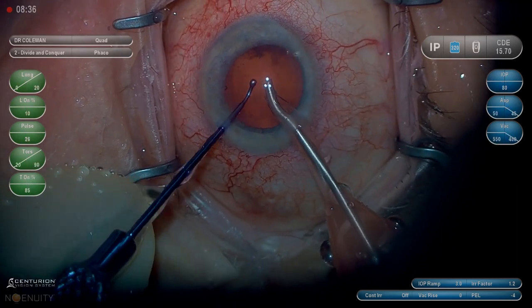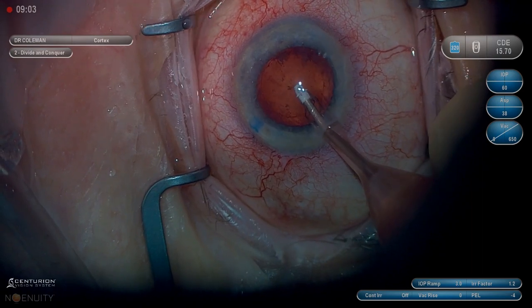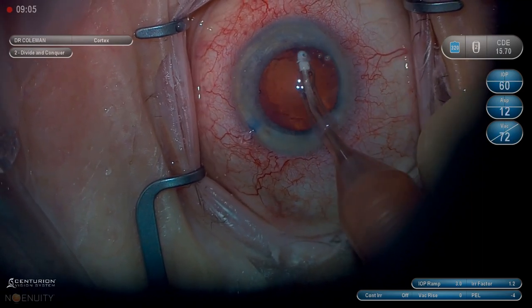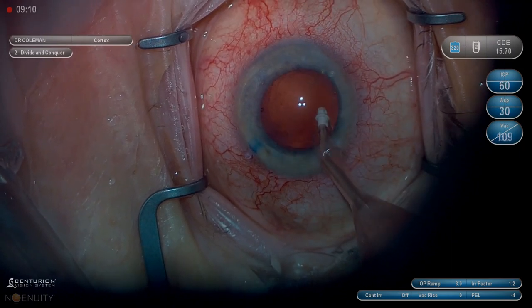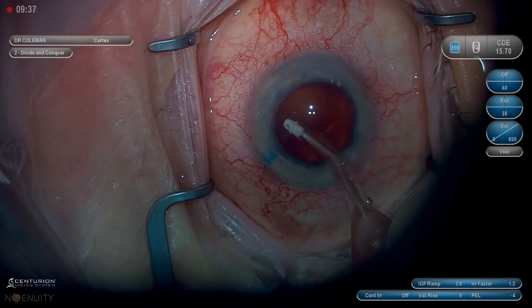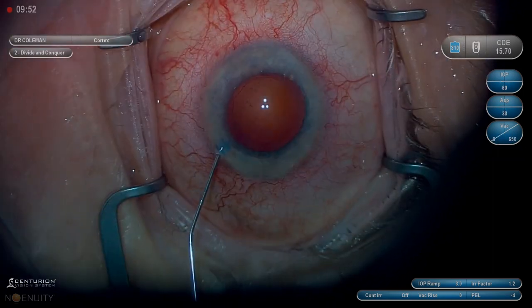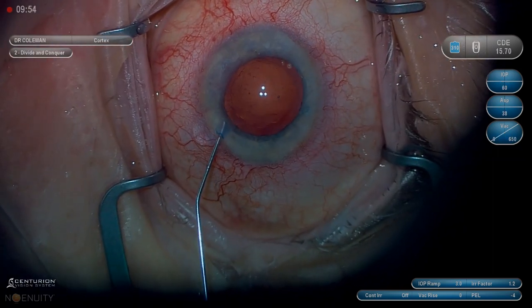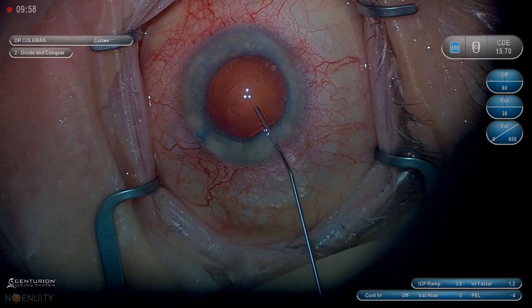As usual with a dense cataract, there's hardly any cortex remaining. Be very gentle with removing it, as sometimes the posterior capsule is brittle and can be more prone to rupture when a nucleus is that dense. I injected a little ProVis through the paracentesis wound to make sure there were no remaining fragments — I'd rather find them now rather than when I hydrate the wound at the end of the case.